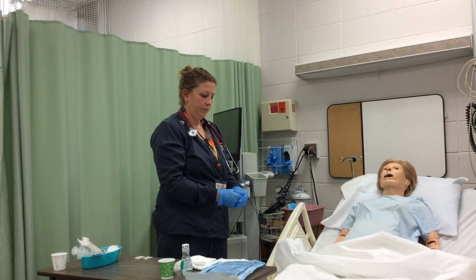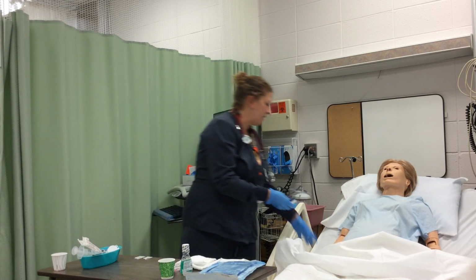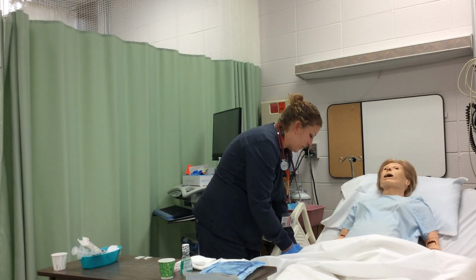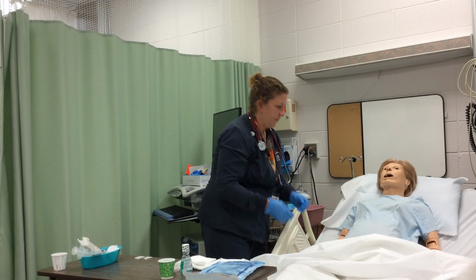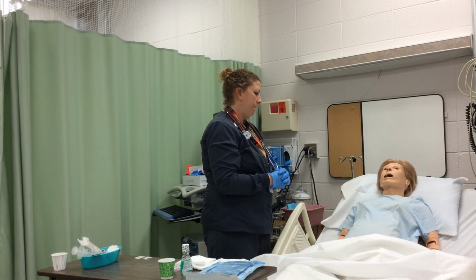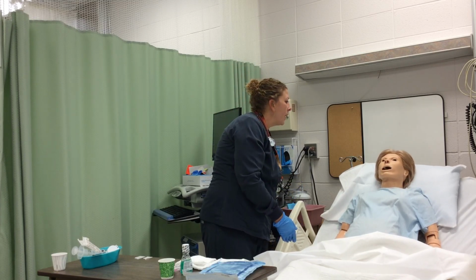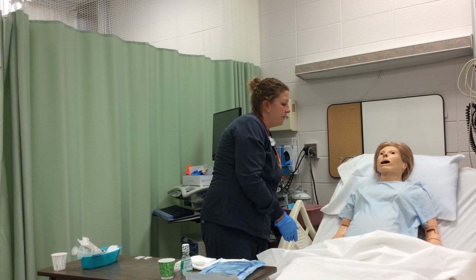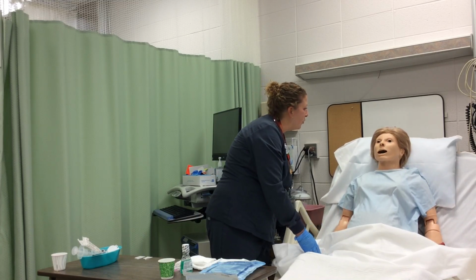Apply the pulse oximeter and measure the patient's vital signs. I'm going to apply this pulse oximeter to your finger during the procedure. Position the patient upright in the high Fowler's position unless contraindicated. Place a towel or chucks over the patient's chest. I'm just going to sit you up as high as possible for when we put the tube in.